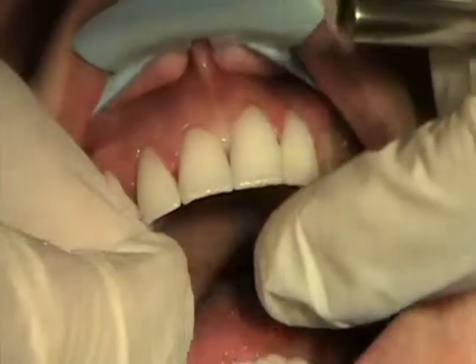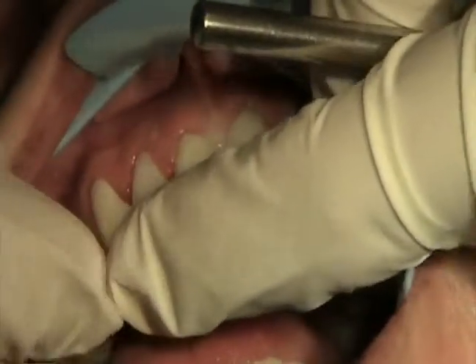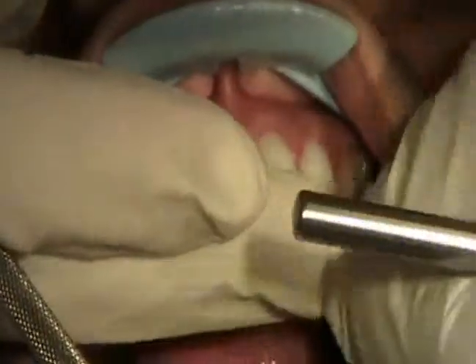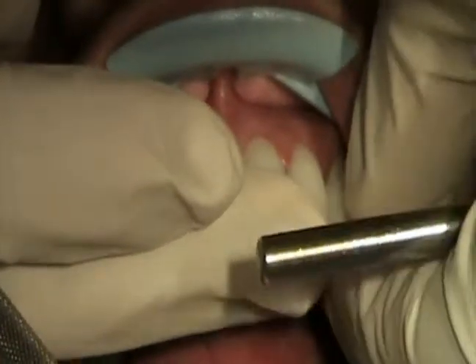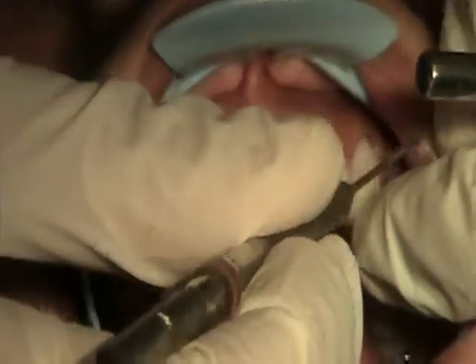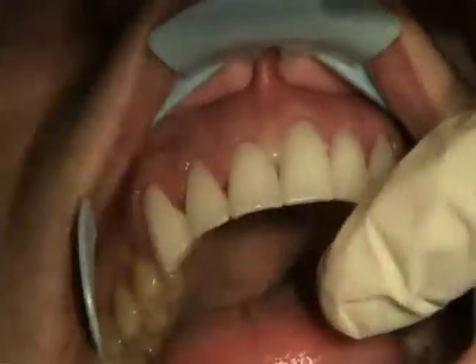I want to make sure every single one of these fits perfectly before we consider cementation. I also want to take into account contours and colors, and make sure that everything looks good and that the patient approves. Check the margins around the edge, make sure there are no edges that are not fitting.